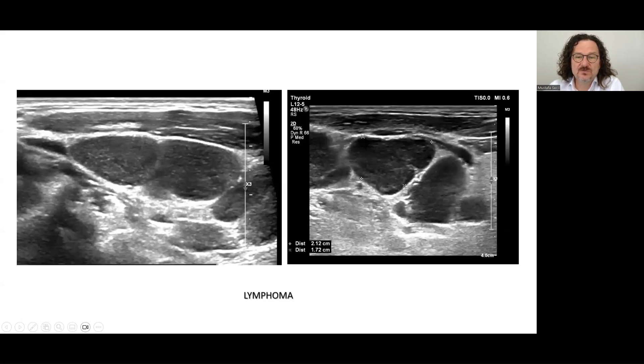These are two typical examples of lymphoma: diffusely hypo-echoic lymph nodes with reticulation inside.